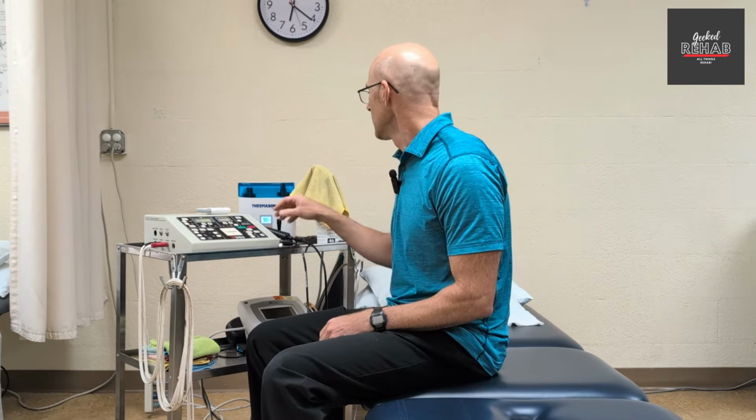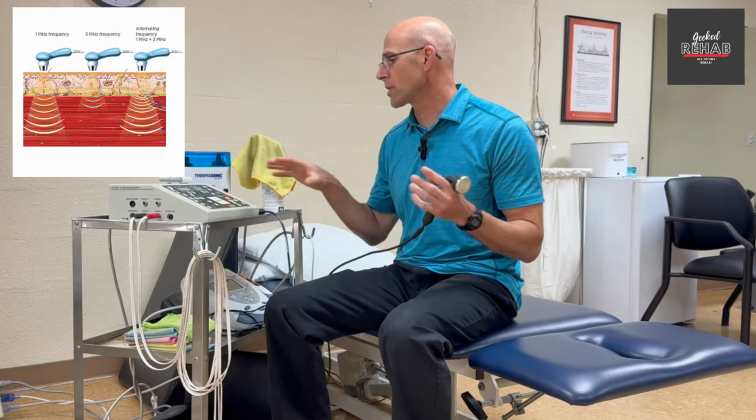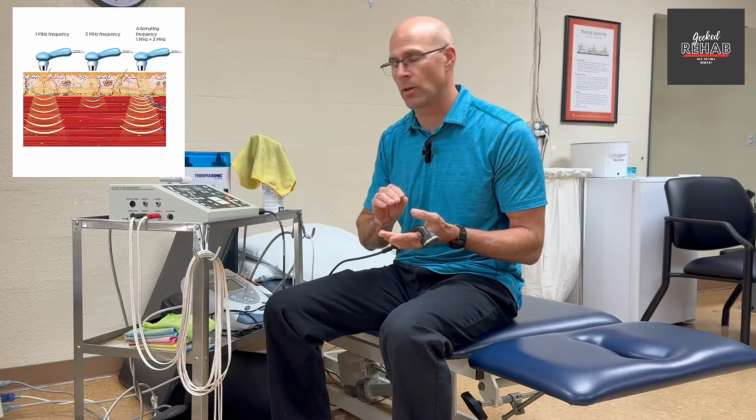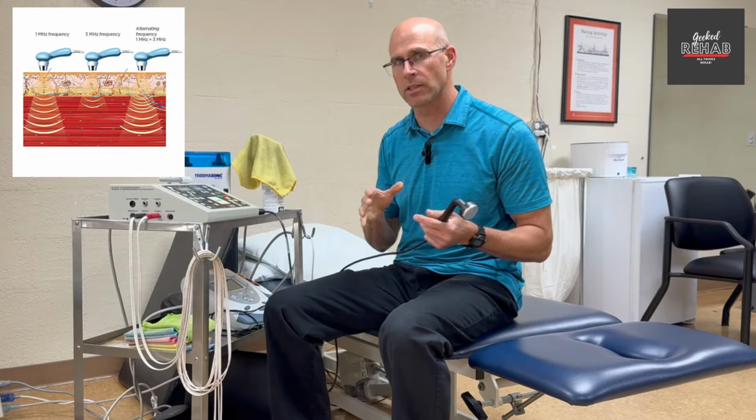Both those settings help increase fluid flow into the area you're doing the ultrasound. You increase fluid flow, well, what's the fluid in our bodies? Blood, lymph, water. Basically, it's trying to create a better atmosphere for healing. And you can change the settings also to target different depths of tissues. So ultrasound is very versatile in getting to different tissues.